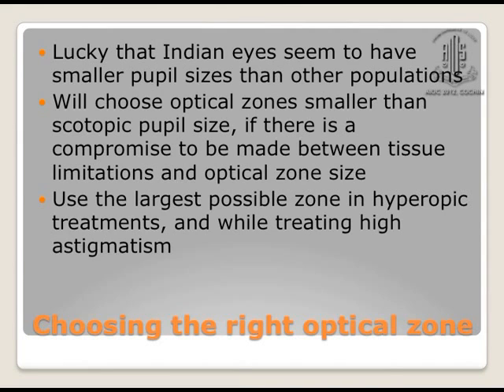In hyperopia, it's a good idea to do as large a treatment for stability of the tear film as well as the treatment. And for high astigmatism, again, you have to be careful and choose a higher zone.